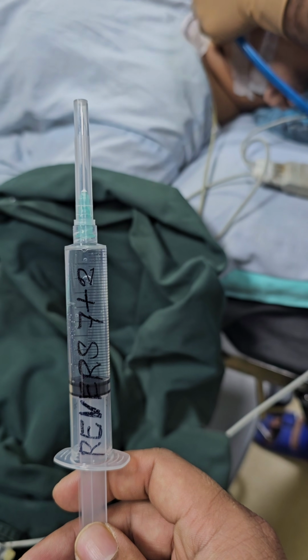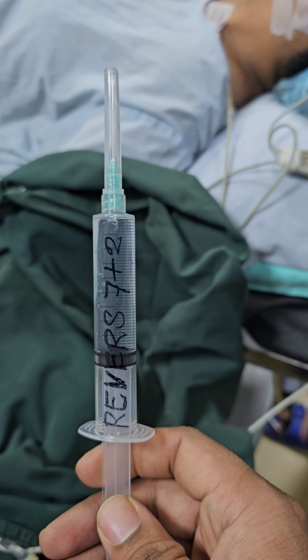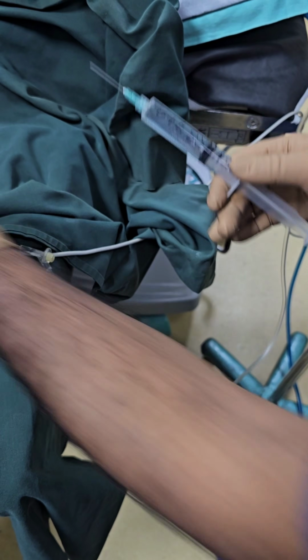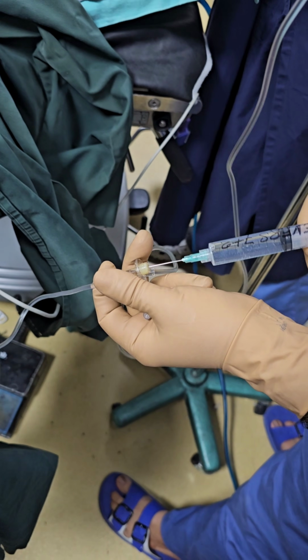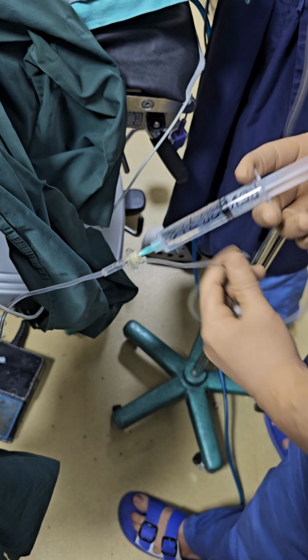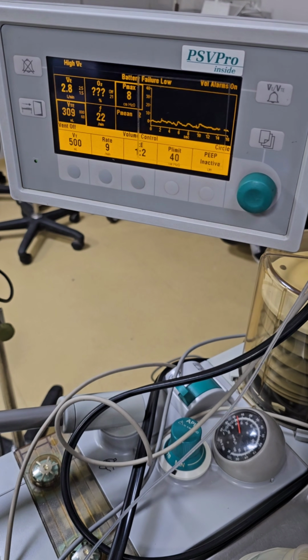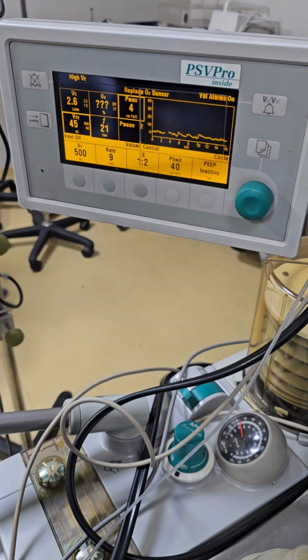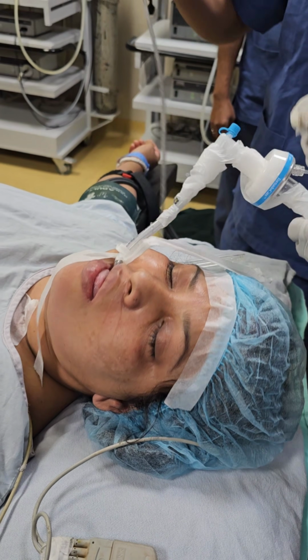The reversal will be prepared with neostigmine ampoules, each of them 0.5 milligram, and glycopyrrolate. And we are going to give the patient the reversal. We give the total reversal. We are seeing the patient is breathing, and she is breathing a tidal volume of 309 ml.